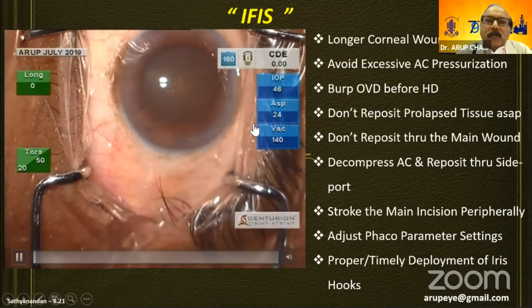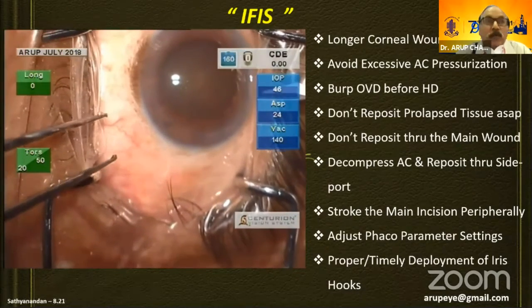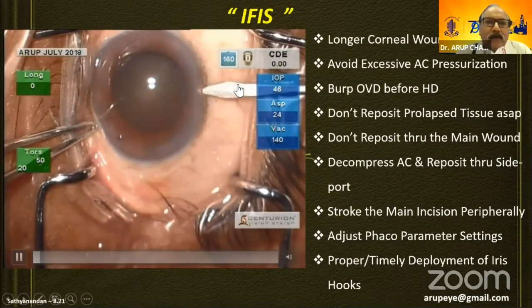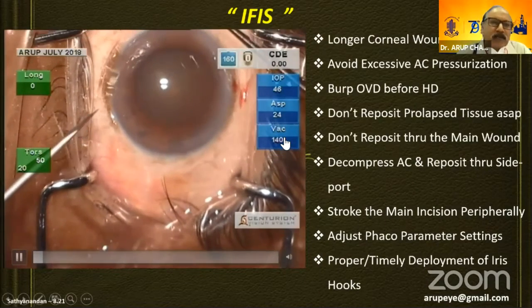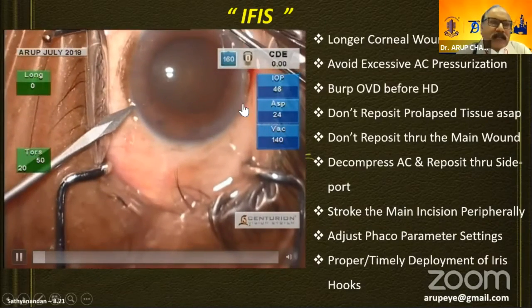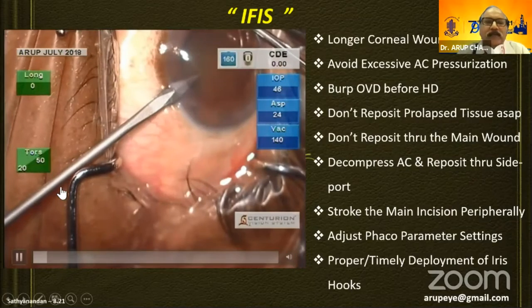The usual thing is you make long corneal wounds in these kinds of situations. The wound should not be borderline. The inferior paracentesis is done with the full MVR blade, the full incision. The superior paracentesis, through which you perform your chopping and nucleus manipulation, should be small, not a full entry, and it will be enlarged later during bimanual irrigation aspiration if you're using it.